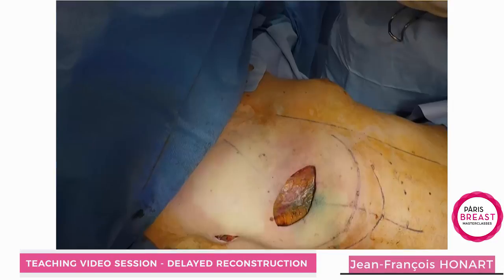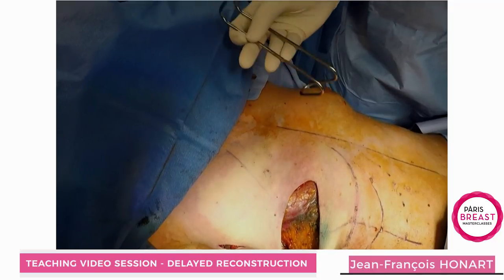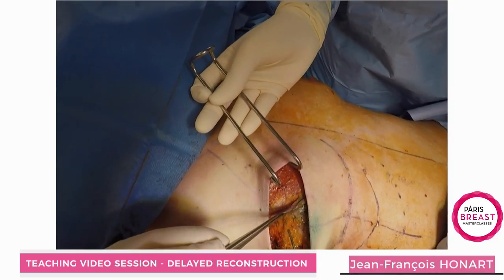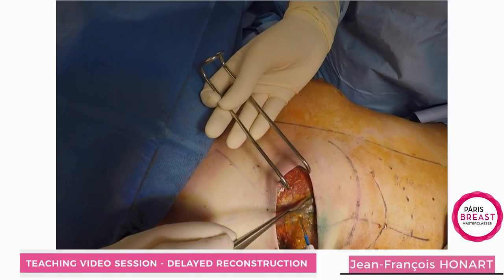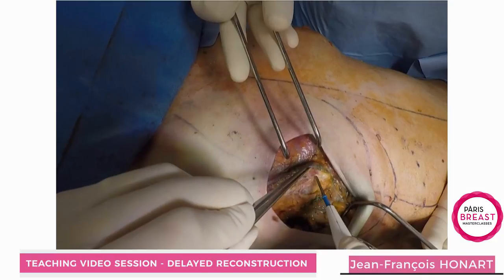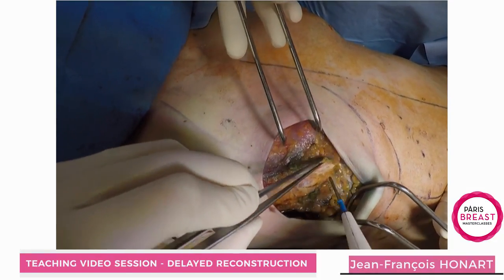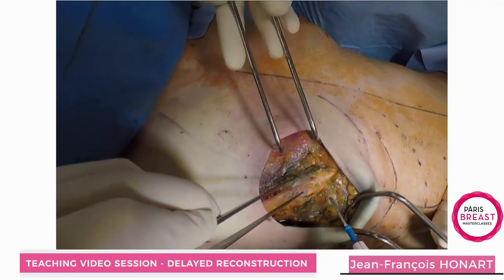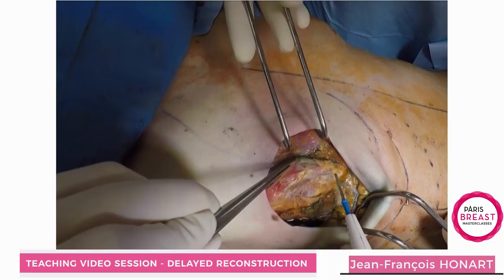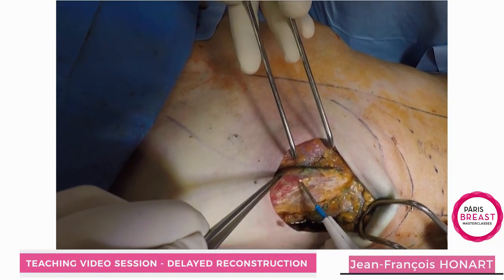We will do the mastectomy, and after that we will start by creating the implant pocket. Today for the same case we would use an expander with meshes or ADM, but a few years ago we didn't have any meshes or ADM, so we used the fascia of the serratus.